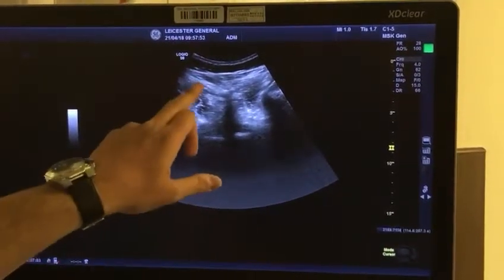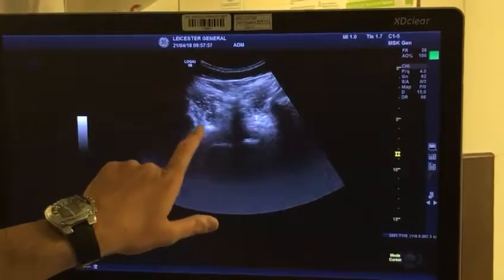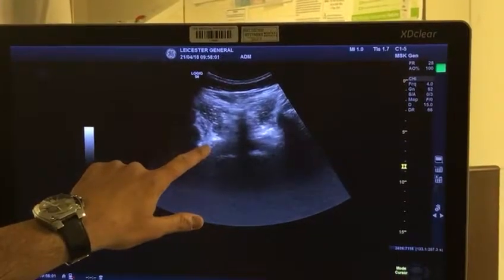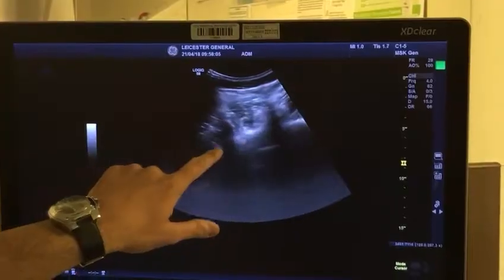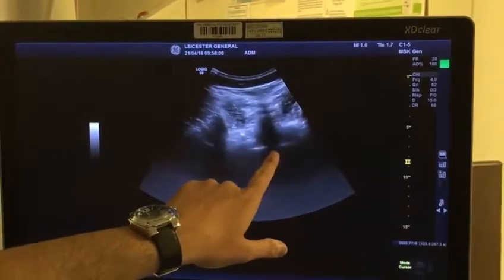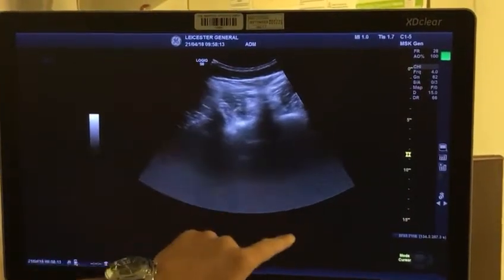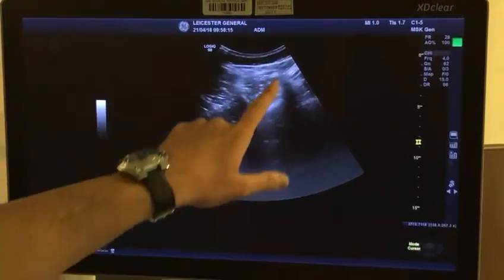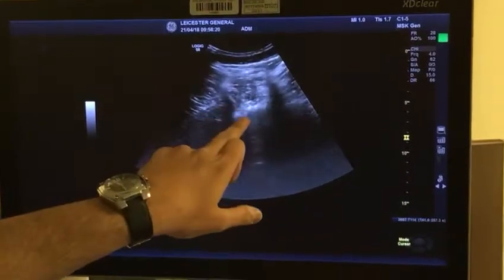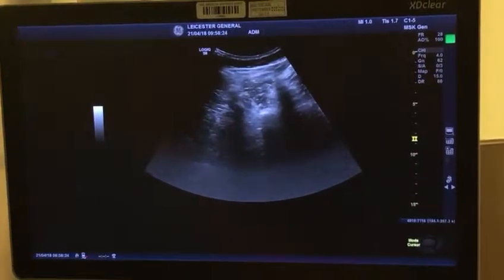Now, when you want to do the L5 dorsal ramus block, this is the target for your dorsal ramus block. Here, this is your sacral ala. So you need to bring that in the middle of the screen. That's your spinous process. But this is the interspinous ligament, because you can see, you don't want to see that when you want to do the L5 dorsal ramus. So you'll bring the needle in that way, put it there, inject the dye, do the X-ray, and then inject the local.